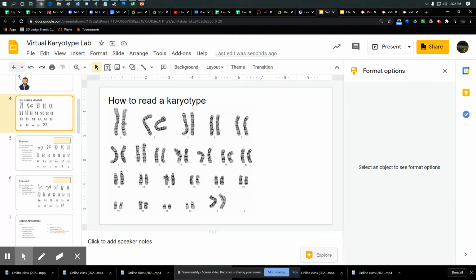Each chromosome has different genes. They're scattered throughout the chromosomes. Towards the end, you get smaller ones. 21 is technically the smallest one. Why it's in front of 22, I've never been able to find out from a scientist. I've asked that question multiple times. No one has an answer, but it just is what it is.